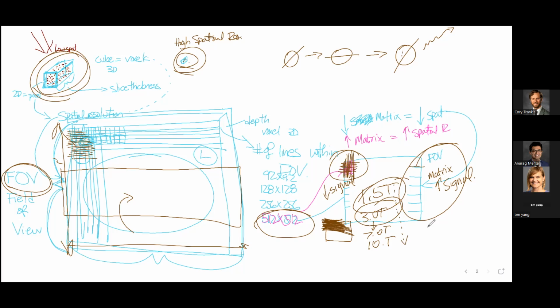So we're going to talk about that next week, and temporal resolution. The higher you go, the more artifacts you get from motion. So for many cardiovascular applications, particularly congenital heart disease where you're doing a lot of blood flow measurements, the lower field strength is much better. Okay, we're going to talk about that next week.